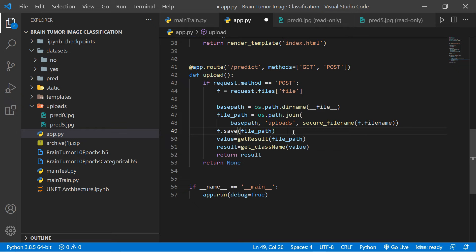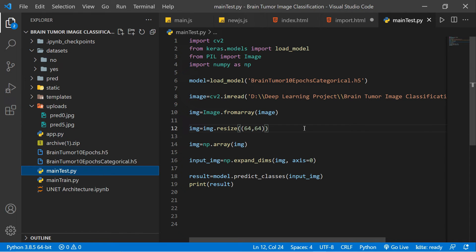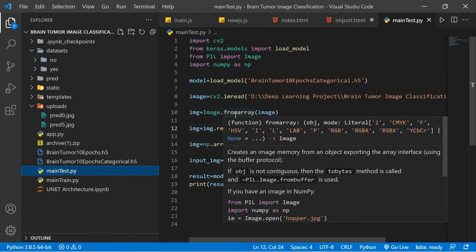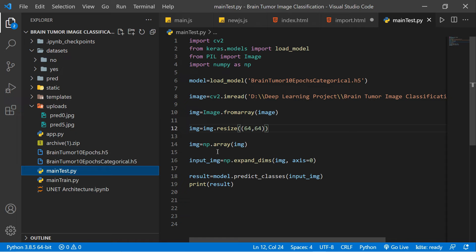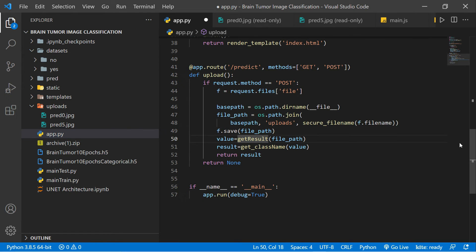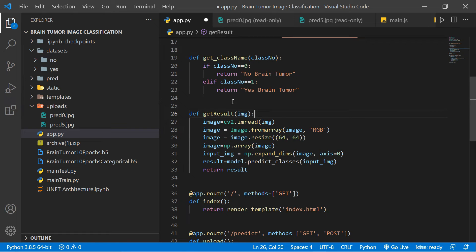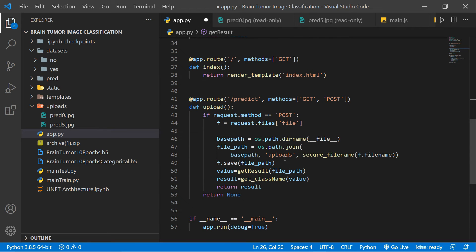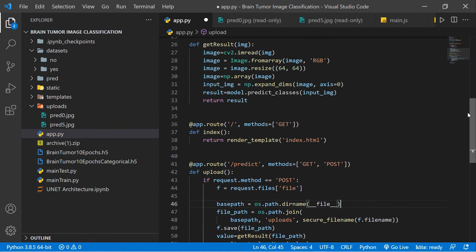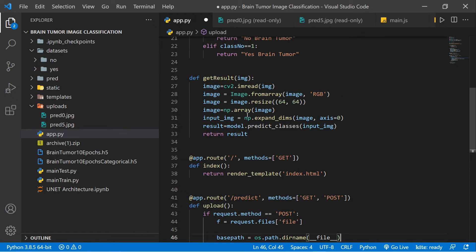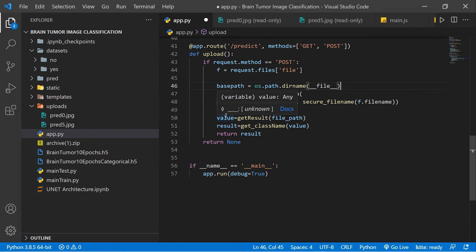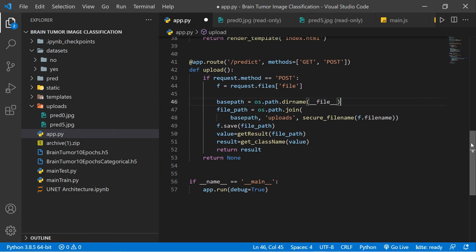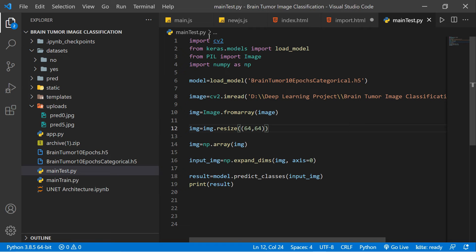Now looking at main_test.py — this is the testing step. First we load the model, then read the image, convert it to an array, resize it, expand the dimensions, and predict the class. We call a function called get_result which takes the image as a parameter. The file path is the full path of the image. We read the image array, resize it, and return the result.